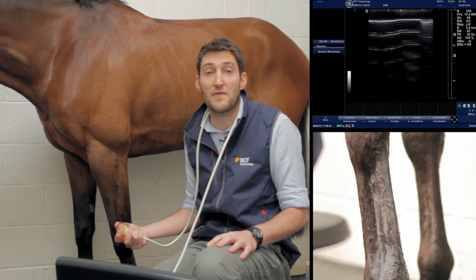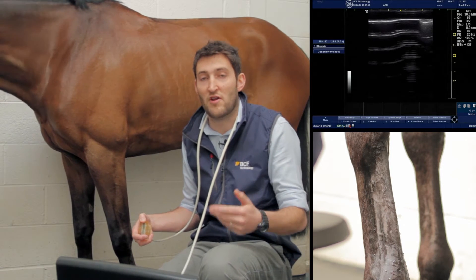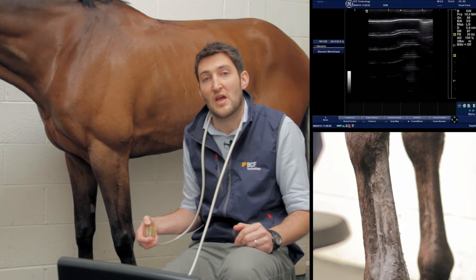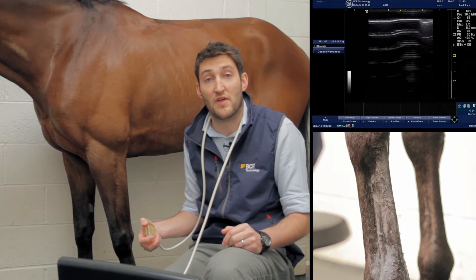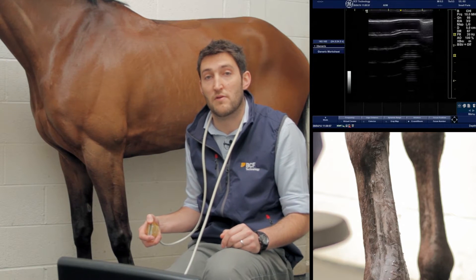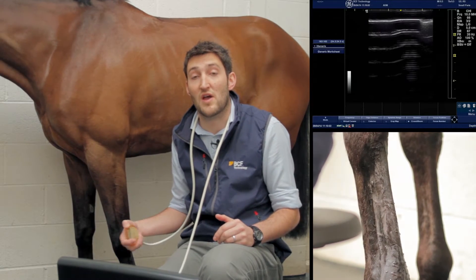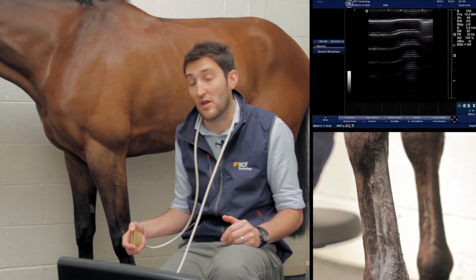The other thing to bear in mind when doing this in practice: you probably work your way all the way down the leg taking transverse section images, and then once you've finished with that, you go and take your longitudinal section images afterwards. For the sake of these videos, whilst we're going down taking the transverse images, we'll also have a look and compare that against the longitudinal images.